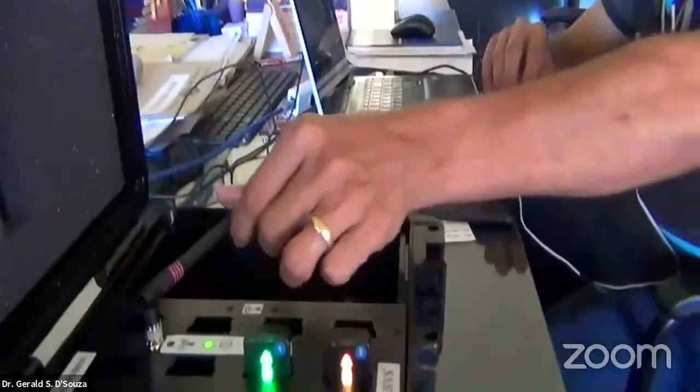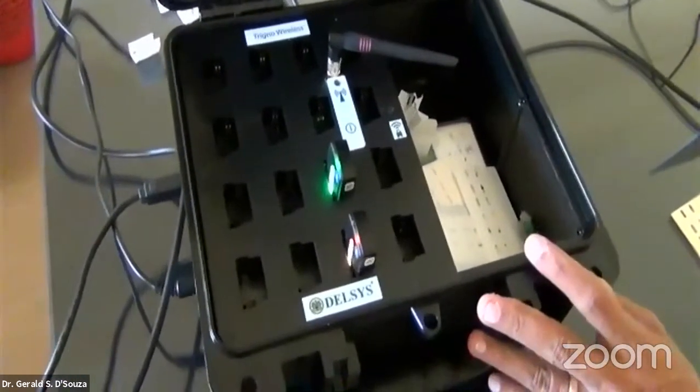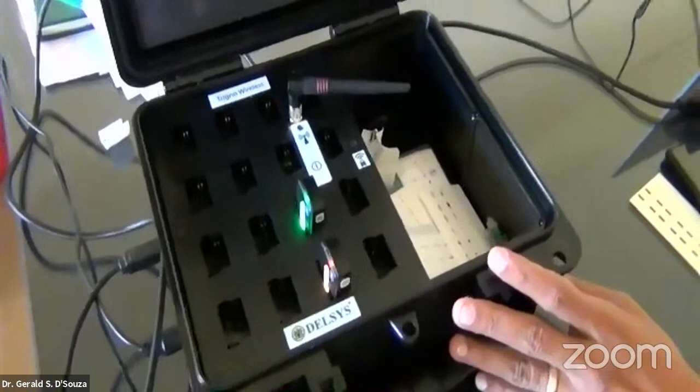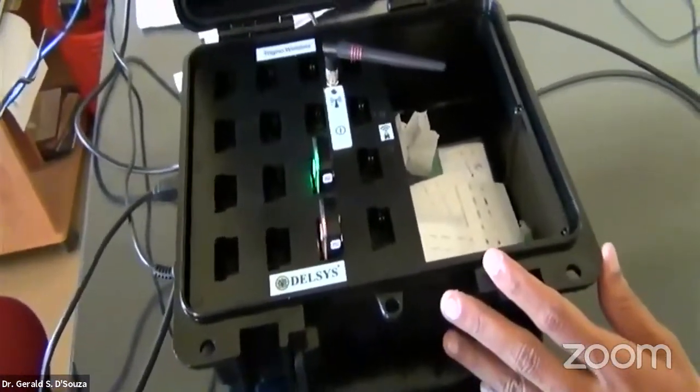Dear friends, this is the Delsys system base station, which has an option to put around 16 sensors. It's expensive, and right now we have two sensors. These sensors were donated by the DeLuca organization.